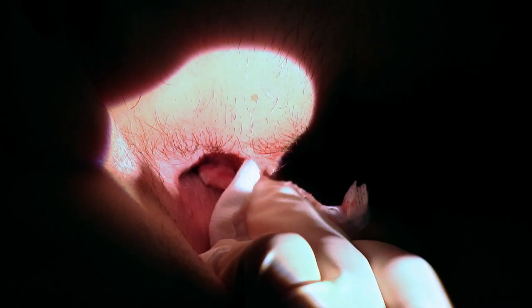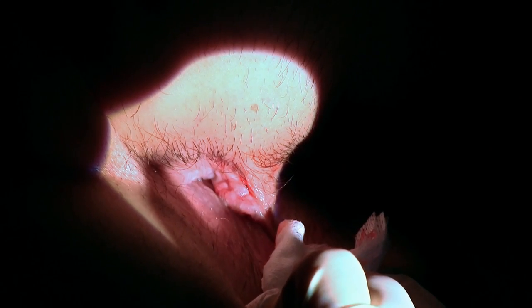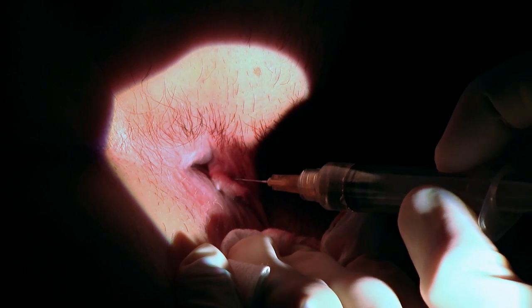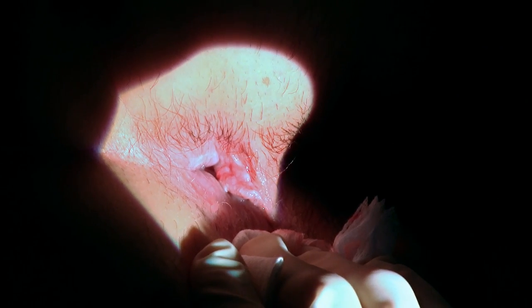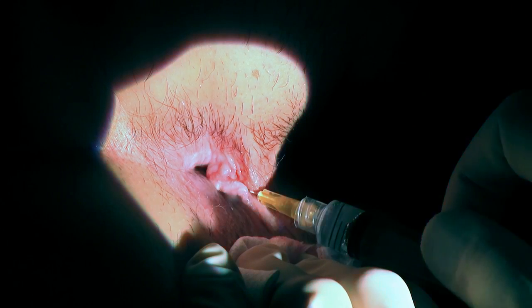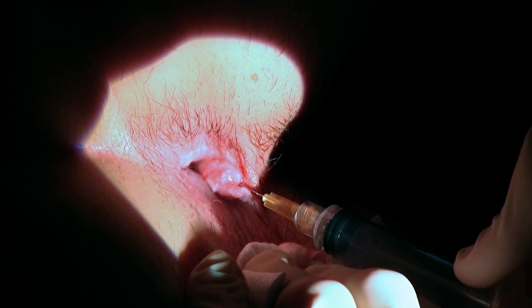The volume of the anesthetic also alters the appearance of the lesion, so you need to be very clear exactly where you're going to do the biopsy beforehand. In this case it's very straightforward because the area of erythema is the area we're targeting. I'll double-check to make sure there's an adequate level of anesthesia — did you feel me touch that at all? No. I'll put a bit more local anesthetic in — about another mil — so we've got three mils in total for a very good level of anesthesia.